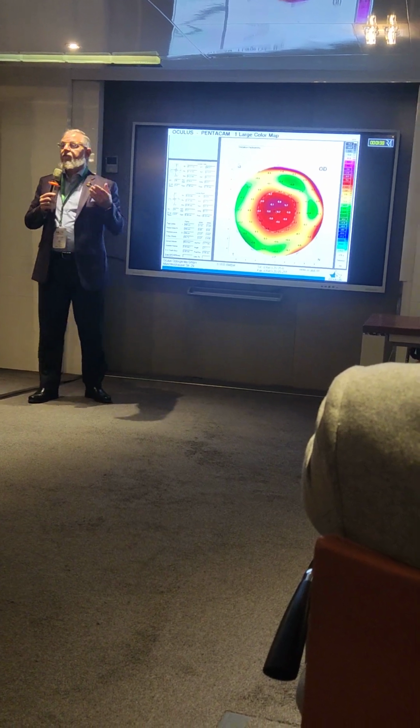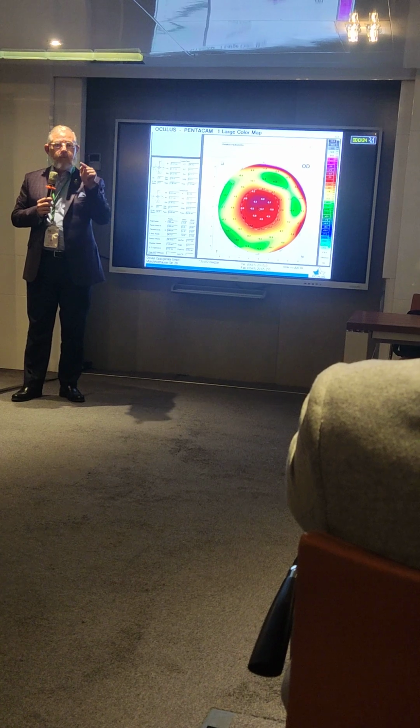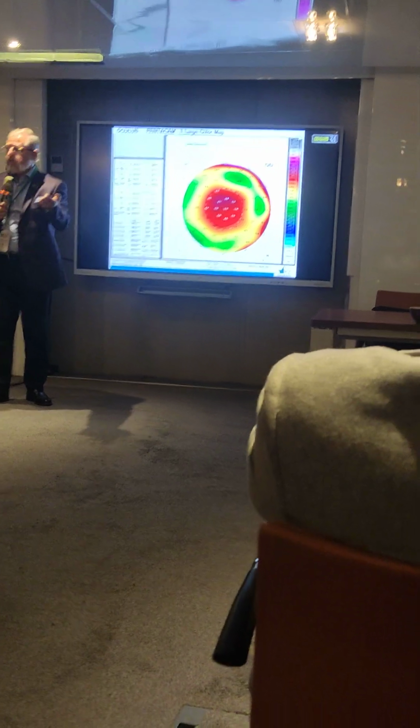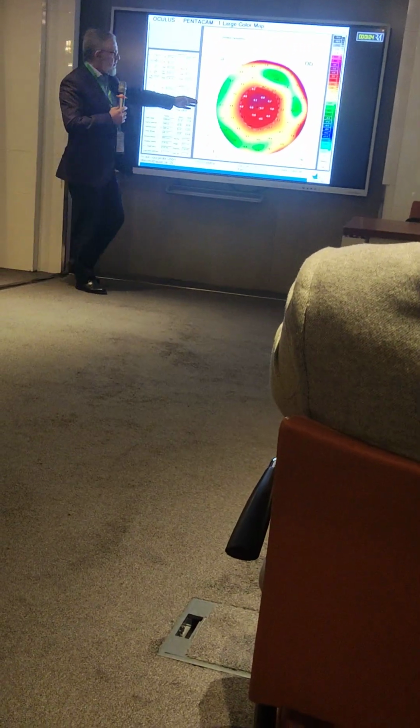And this is not only for fancy that you have done something. No, it is for the biometry, because the machine will ask you, did the patient have previous LASIK? Yes, it was myopic or hyperopic. Accordingly, it will choose the best formula for you. So you have to know by this.